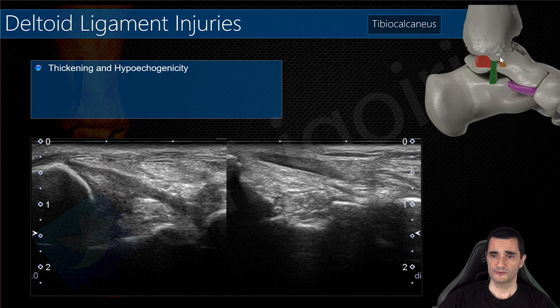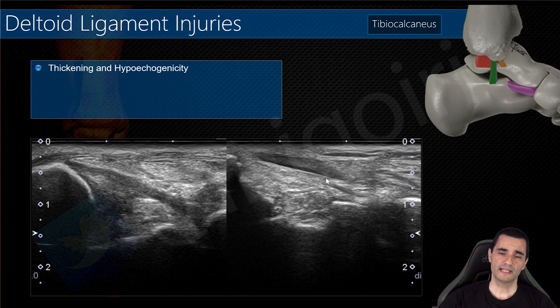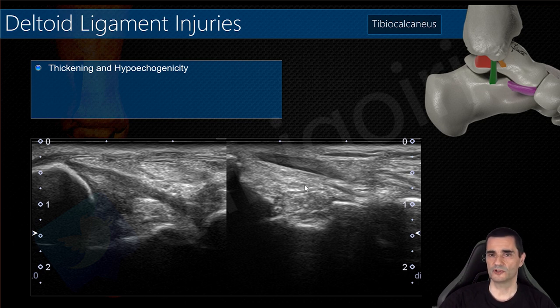The tibiocalcaneal ligament is the first we check — you can see between the tibia and the sustentaculum tali this thickening and hypoechogenicity of the ligament, if we compare with the contralateral side. Remember it is very uncommon to find an isolated component affected with the rest of the ligament normal — usually several components are affected.